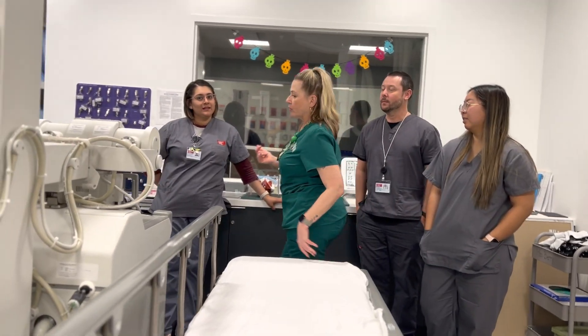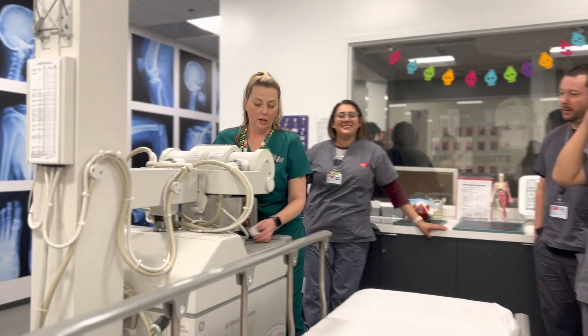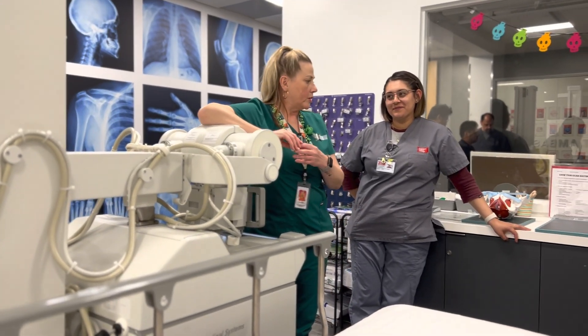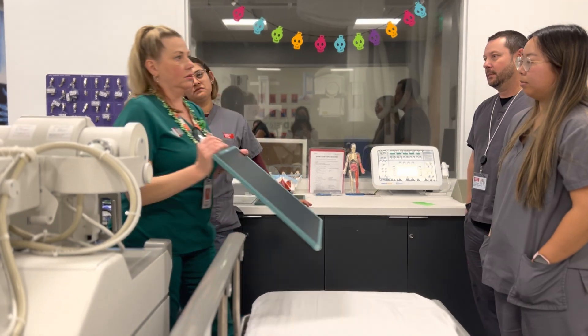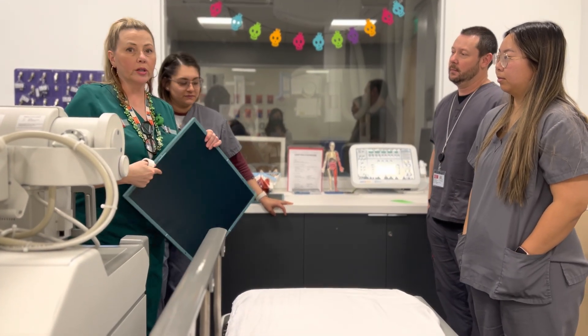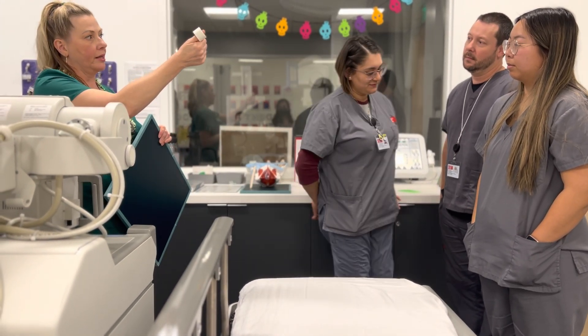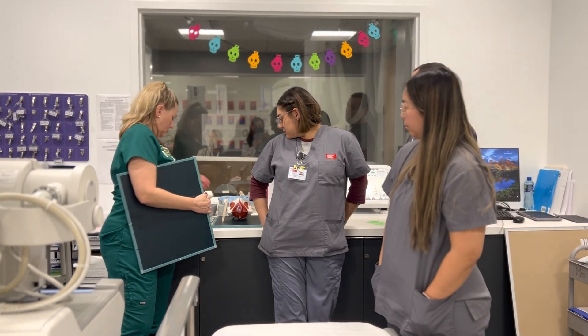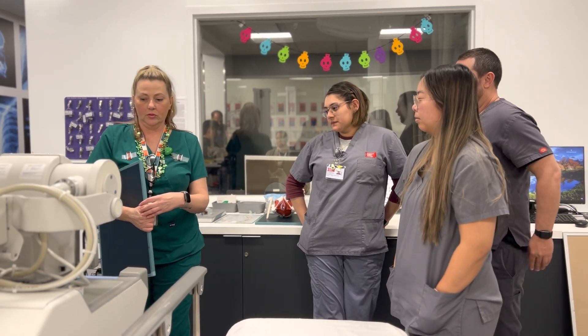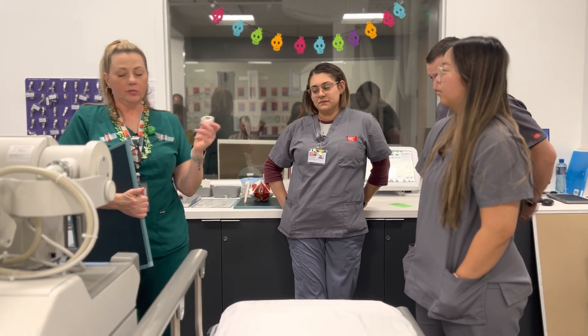I get my requisition and it says pelvis, so there's a couple of things I'm going to bring with me. I've got my 14 by 17, and I'll have a grid with me too, plus I'm going to bring a tape. Normally I like this kind of tape, but I have a lot of this tape, so I'm going to use this.